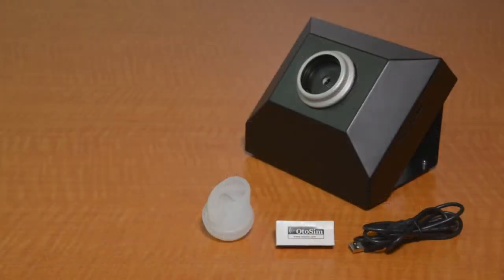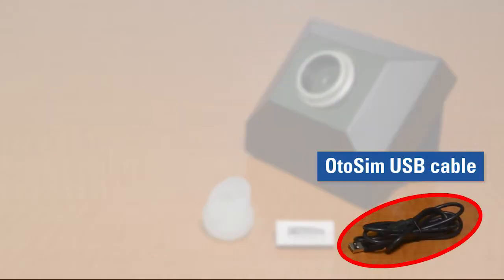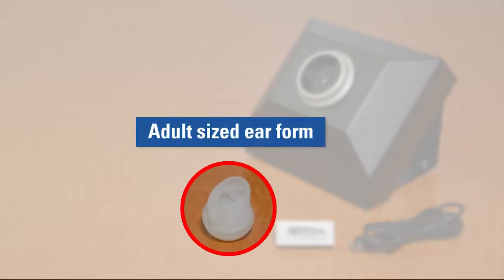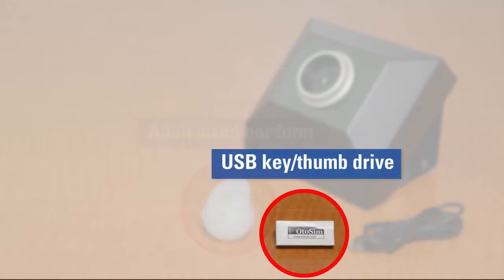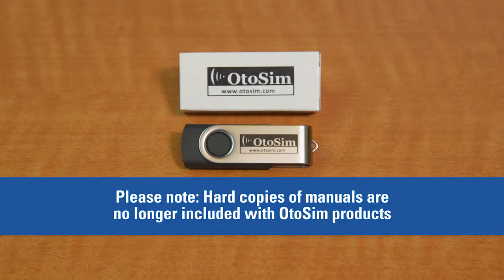Your OdoSIM system consists of the following components: 1. An OdoSIM base unit. 2. A USB cable. 3. An adult-sized ear form. 4. An OdoSIM USB software key. The USB key also contains a PDF of the OdoSIM product manual. Please note that we no longer provide hard copies of product manuals.